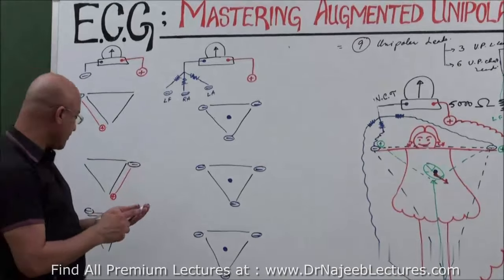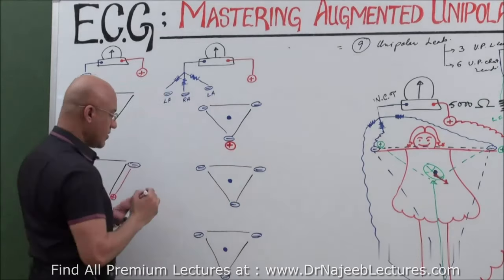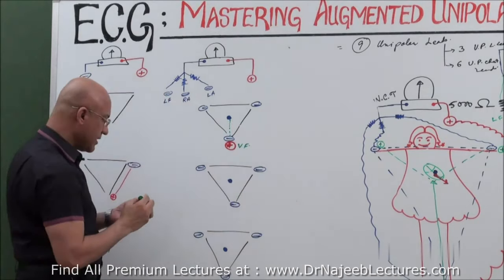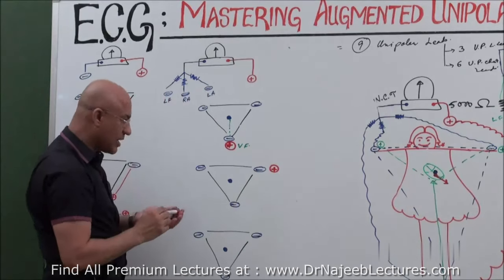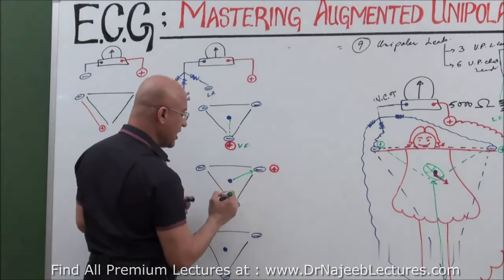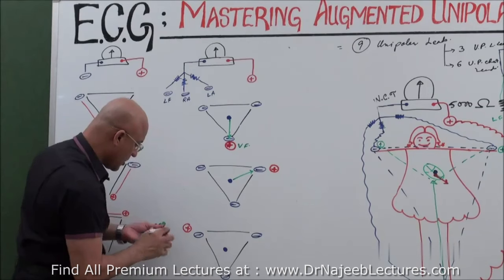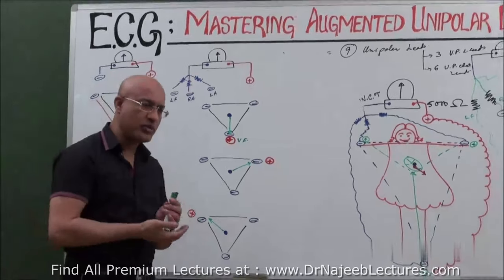Yes. Now, Mr. Wilson, first of all, put a positive electrode here. What did he achieve? What is this lead? VF. Then he put positive here, but the other two remain negative. So what is this now? VL. Is that right? And this is VF. And then he put positive here. What was this? VR. Is it clear? Any question up to this?